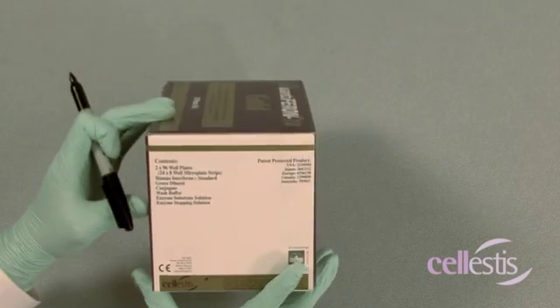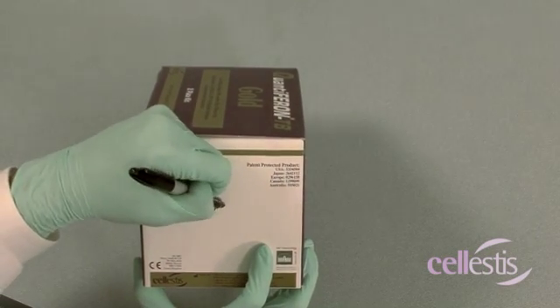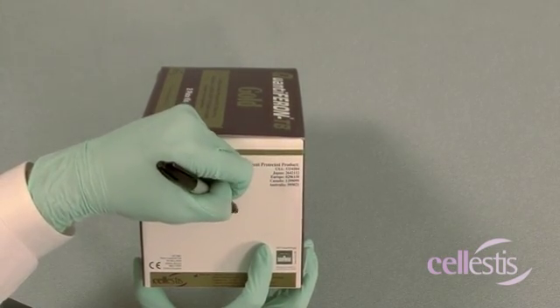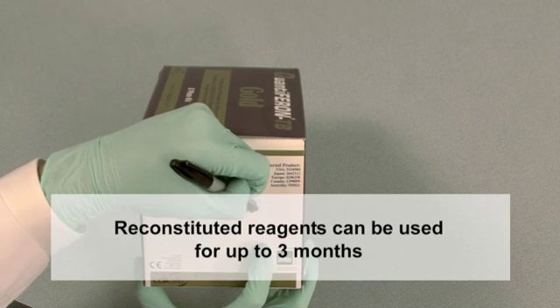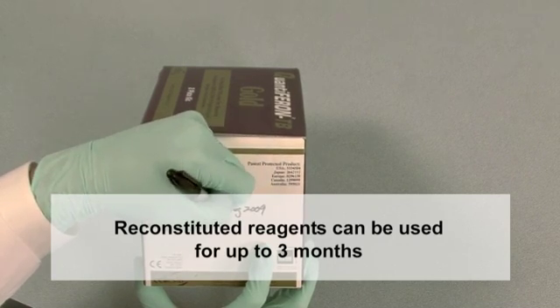It is good practice to write the date of reconstitution on the ELISA box. Reconstituted reagents can be used for up to three months from this date.